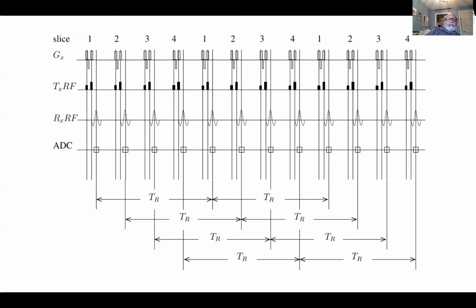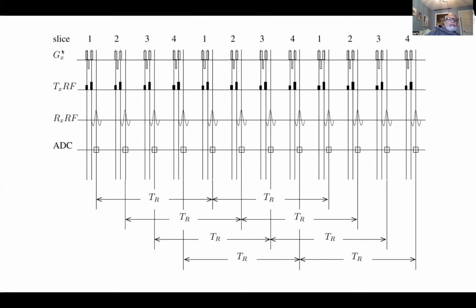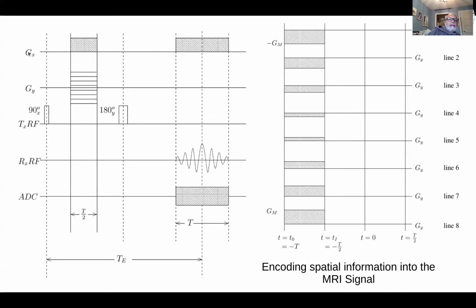So what we need to do, so that's slice selection. And then thinking in terms of what happens on the transverse plane in that rotating frame, we're now going to add other slices. So really, to make these two things consistent, probably I should have chosen Z direction as a slice direction here. So think of that as GZ for slice selection when you look at X and Y here.